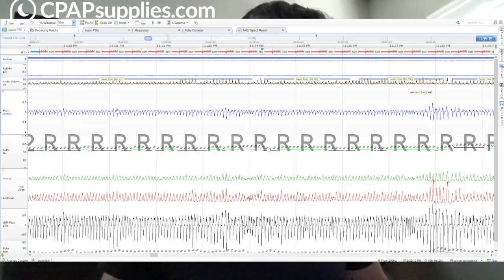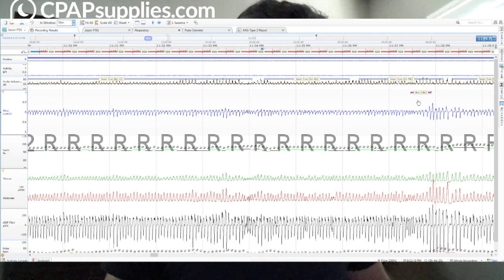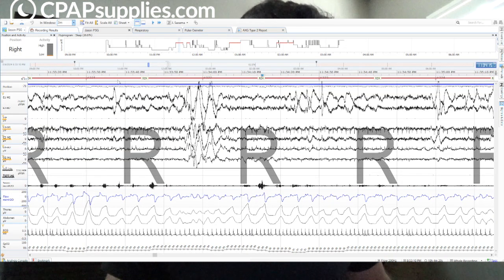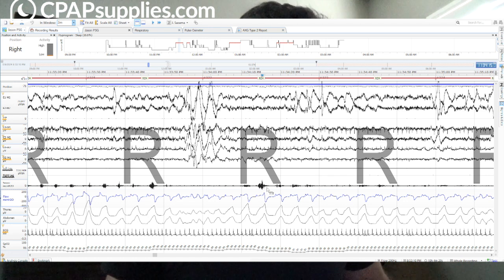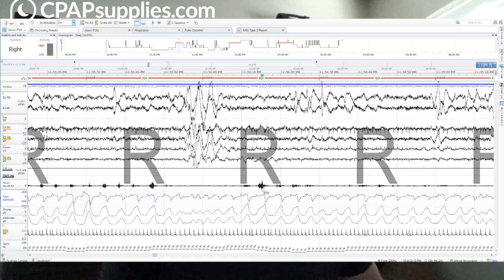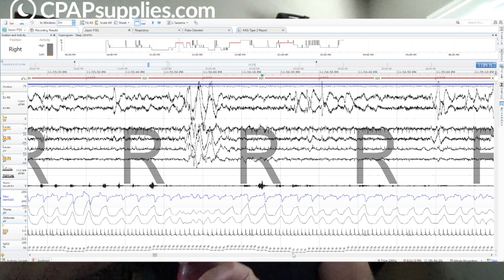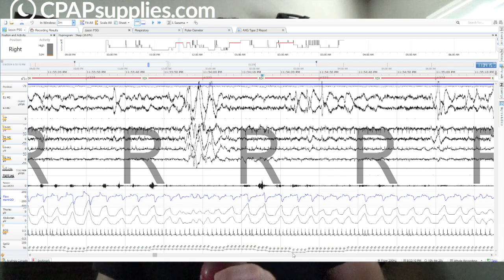But let's see. If I expand out to respiratory, you see how there's like this slow rolling pattern here for the breathing. But yet we haven't seen any awakenings. There is one over here. We haven't gotten to that yet. But there's a slow rolling pattern that's normal during REM breathing. So it's going to look like stuff like this. You might have louder or higher snores. Doesn't mean they necessarily woke up there. You'll see blood oxygen saturations. Doesn't necessarily mean there was any real cause for it other than normal REM breathing.